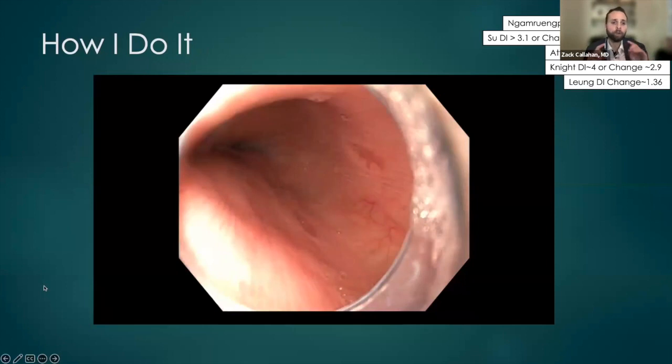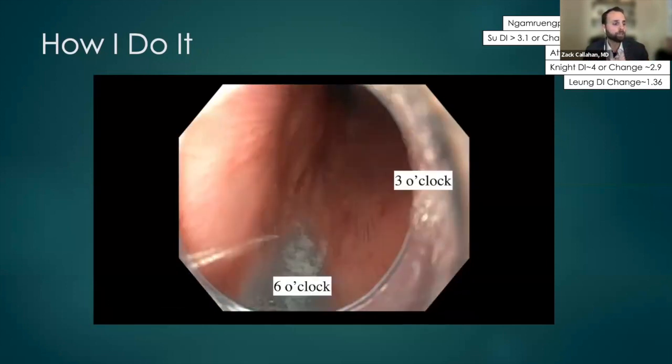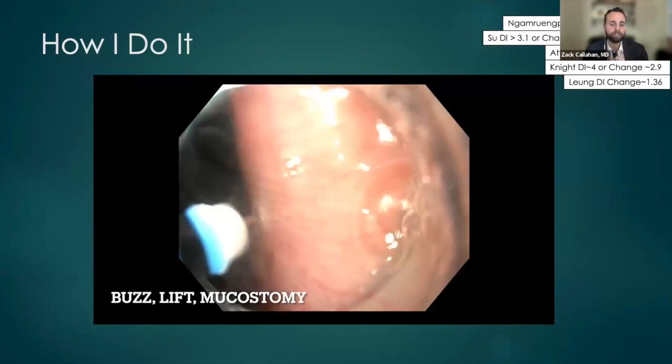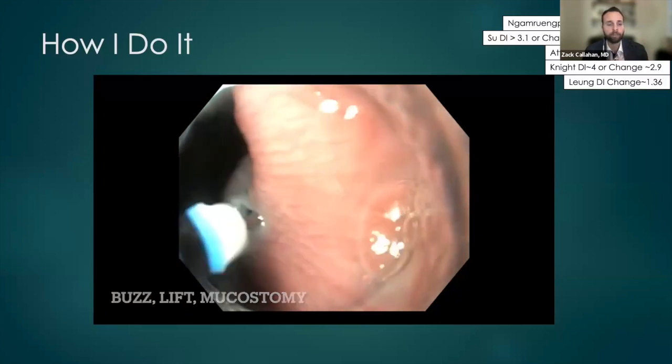So I always like to EndoFLIP. Looks like we're lagging a little bit, but I always like to EndoFLIP before pushing the endoscope down. I think the endoscope will dilate up those numbers, and that distensibility might be artificially higher than it should be. So I always put the EndoFLIP catheter down first.